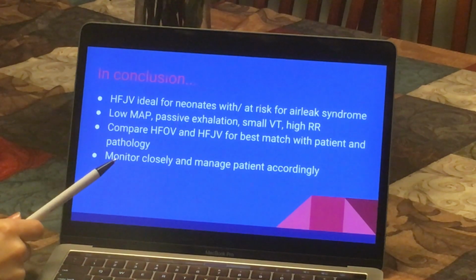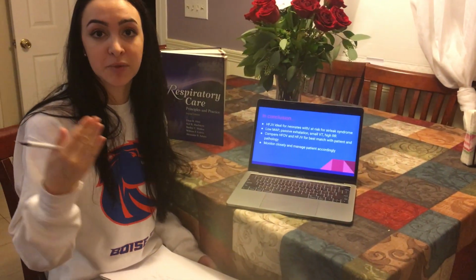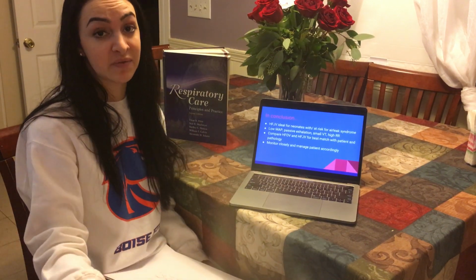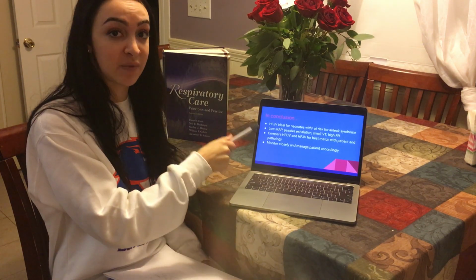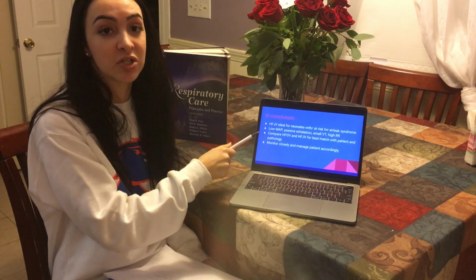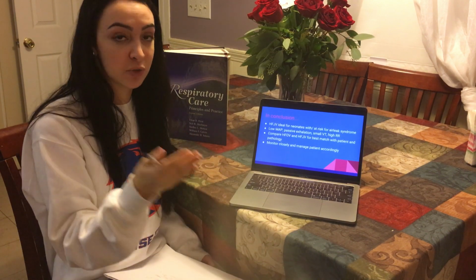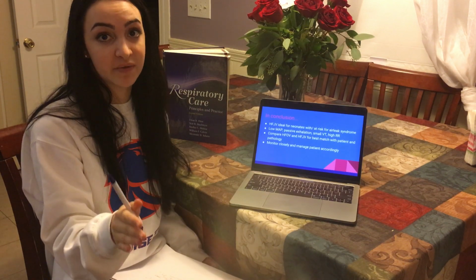And this is very important because many times the respiratory therapist is the person that knows the most about high frequency. We're the ones to bring it up in rounds. We're the ones to bring it up to the physician, and it's up to us to advocate for our patients. If this is the best type of ventilator that's going to work for your patient, it's very important that we bring this up in a timely manner, because capturing your patient with the jet is much more effective than a rescue setup of the jet.